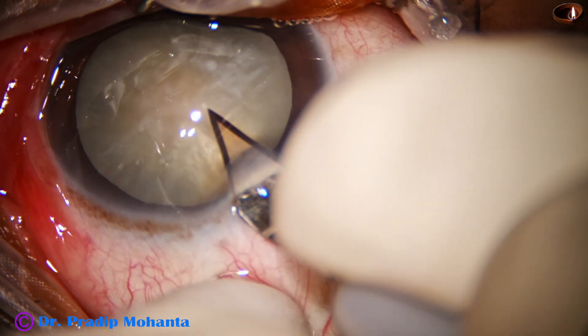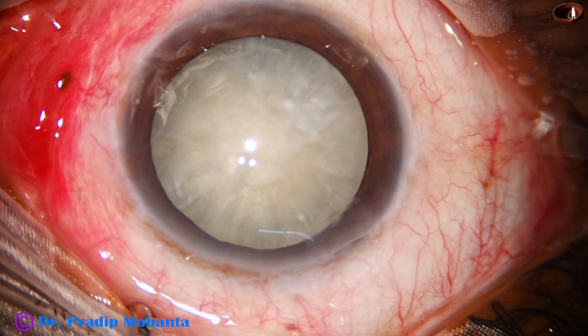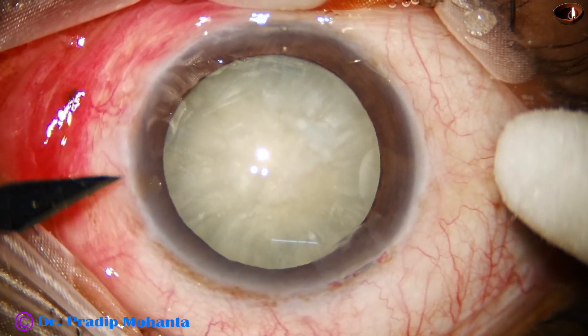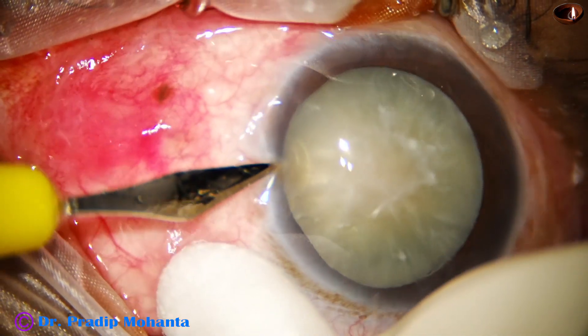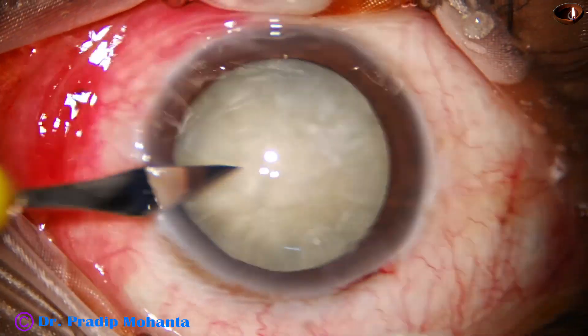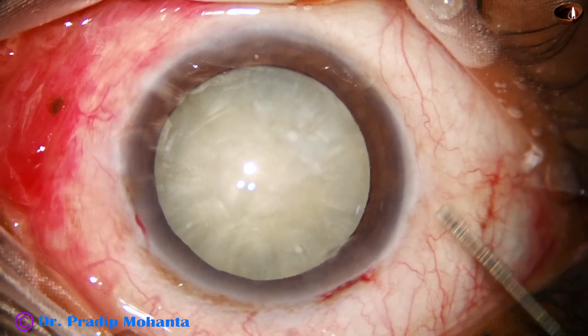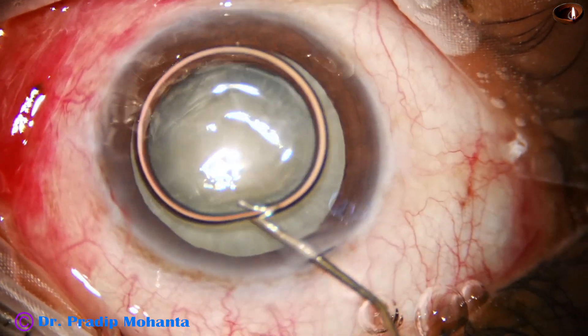This is the main incision on the posterior aspect of the limbus with a 2.8 millimeter steel keratome. A side port is made on the left side of the main incision about three and a half clock hours away. Ideally it should be about three clock hours away.